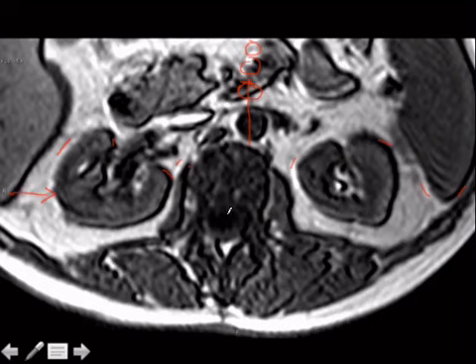But for abdominal imaging, phase encoding, just remember that picture of the aorta with the pulsation artifact, and frequency encoding in this direction. Remember this picture where it's white, black, in that direction.